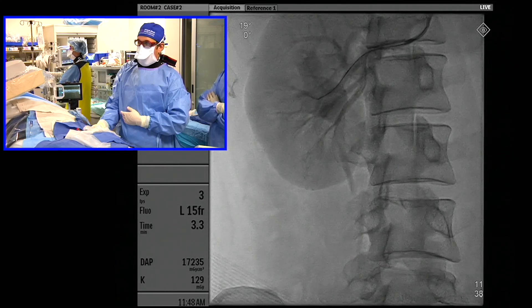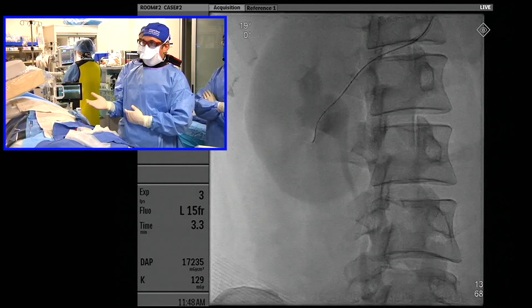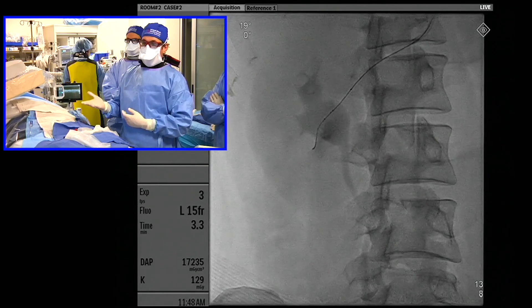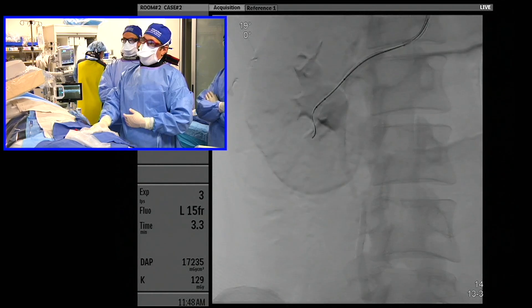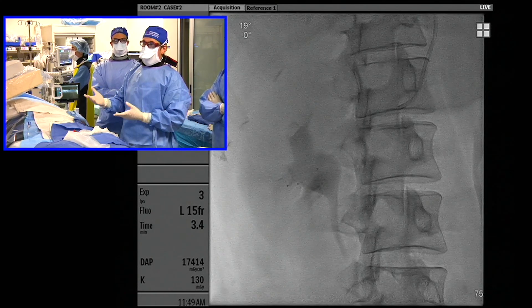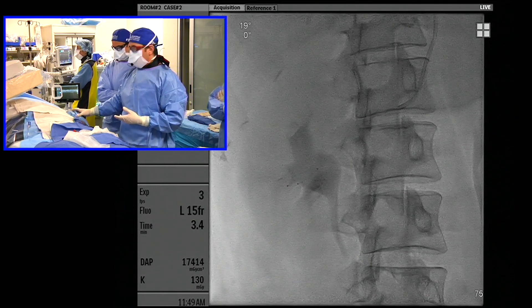We have our microcatheter in position. This is an 014, 200-centimeter Fathom wire, which works really nicely with the Scepter. You really need to use an 014 wire or smaller, which is pretty typical in our lab — we use 014 and 016 wires often. The Ultimate shape is great because we use it for liver, kidney, et cetera, and you can see how nicely it cannulated — that was not an issue at all.